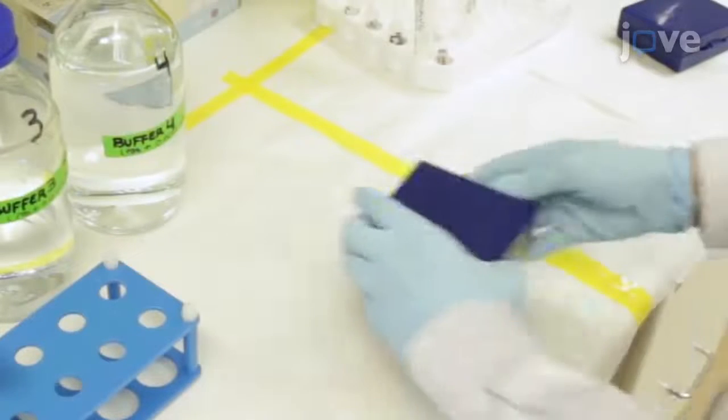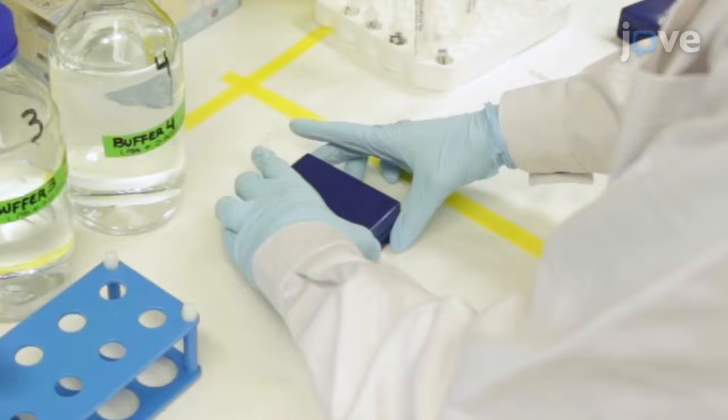To prepare the glycochips and samples, put the storage box with the slides on the table until they reach room temperature.